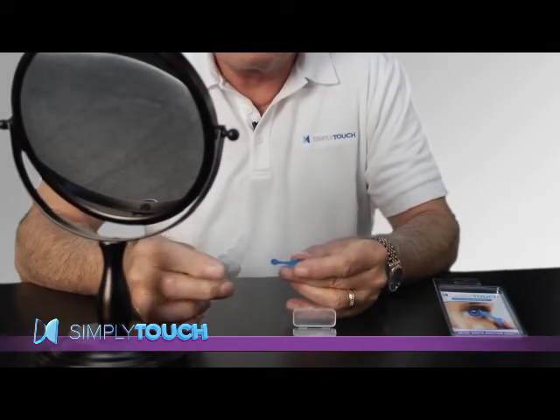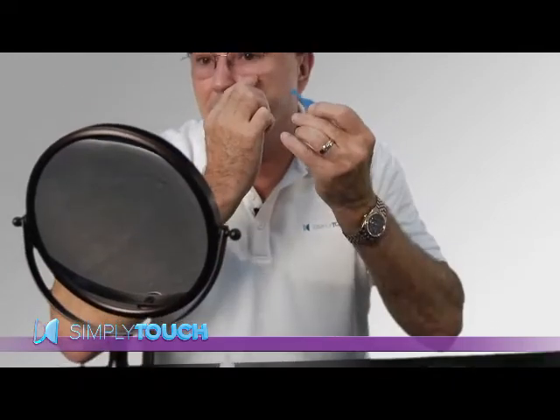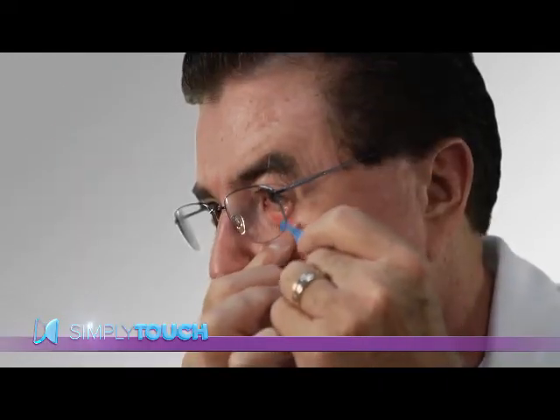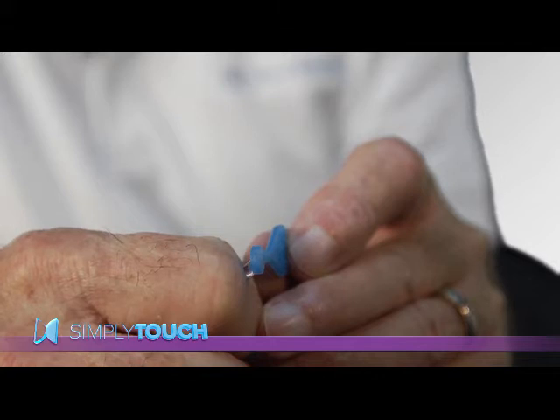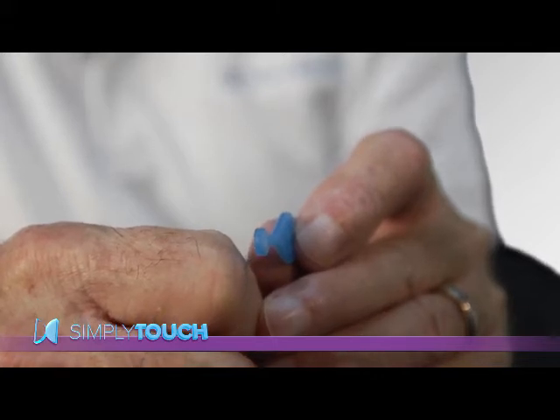Now let me show you how to apply a drop. Wash, rinse, and dry your hands and applicator before each use. Looking in a mirror, use your finger to gently pull down and create a pocket. Bring the applicator up to the lower lid and allow the drop to touch the pocket. See only the drop touches, not the applicator, and allows the drop to transfer.